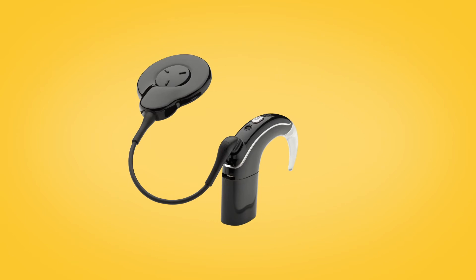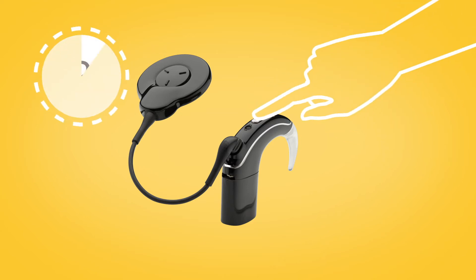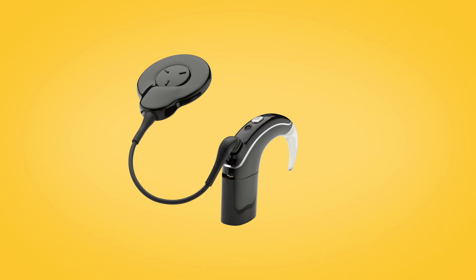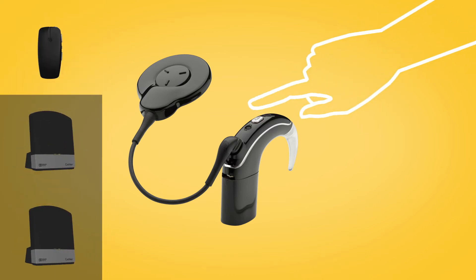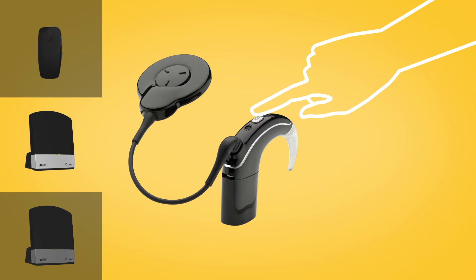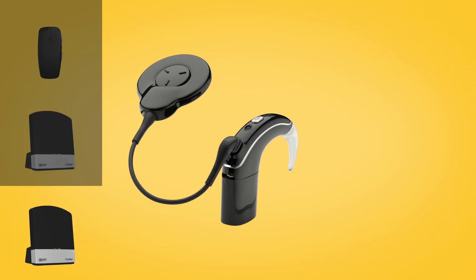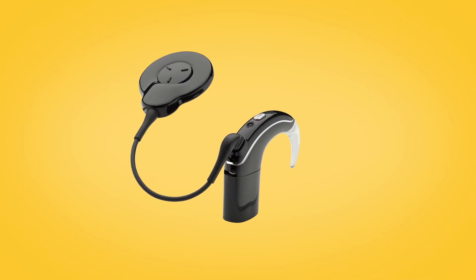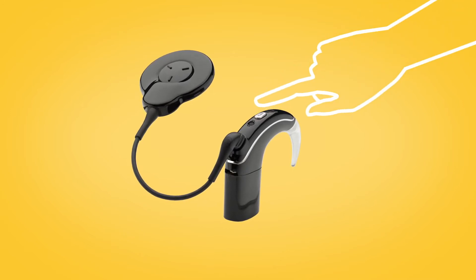You can choose from up to three streamed audio options using the button on your Nucleus 7 sound processor. Press and hold the button for two seconds to cycle through telecoil, if enabled, and then your True Wireless accessories in the order in which they were paired to your processor. To stop streaming, short press the sound processor button.